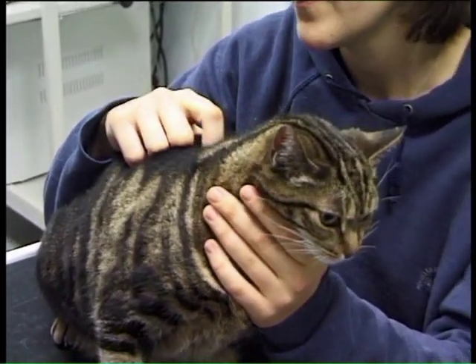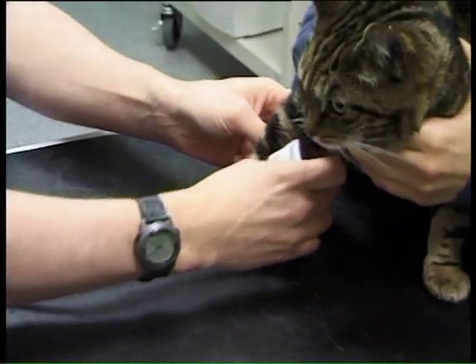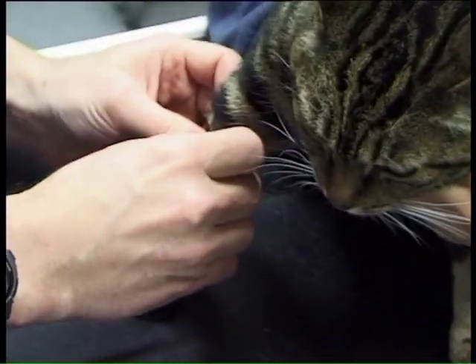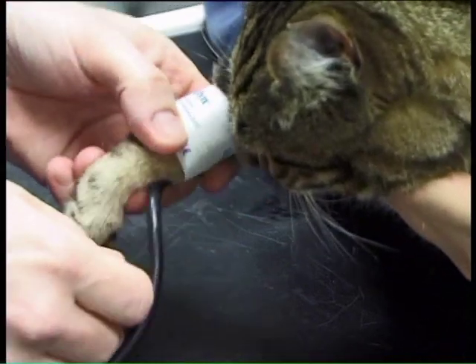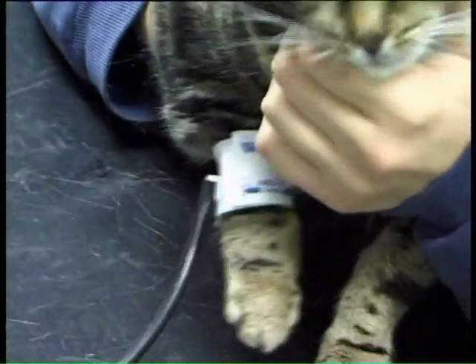So we let the cat settle down for a few minutes, and then we put the cuff around the forelimb, so that it just fits snugly around the forelimb. The area where we actually detect flow of blood is the common digital artery, which we can detect between the carpal and metacarpal pads.